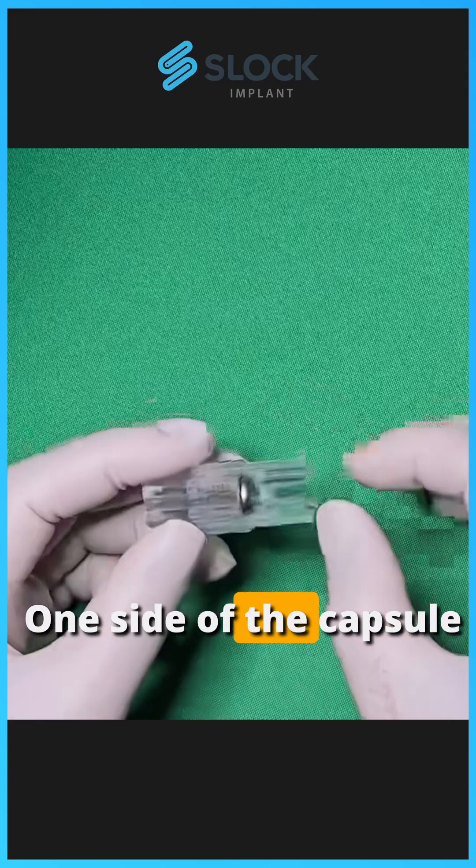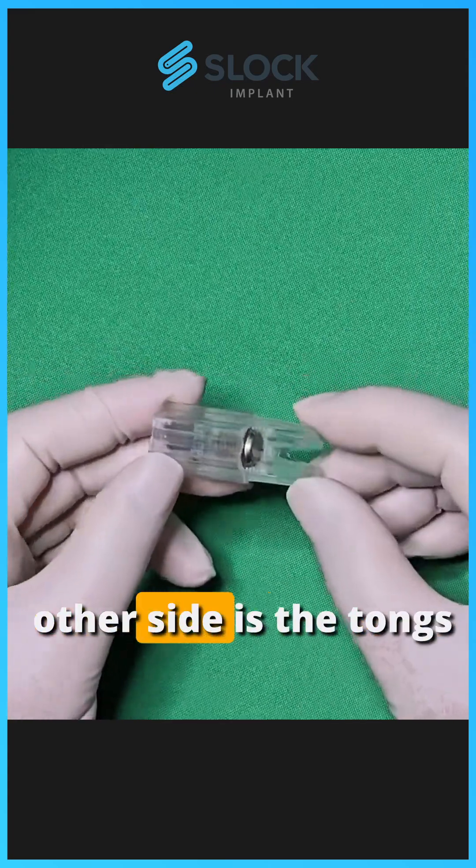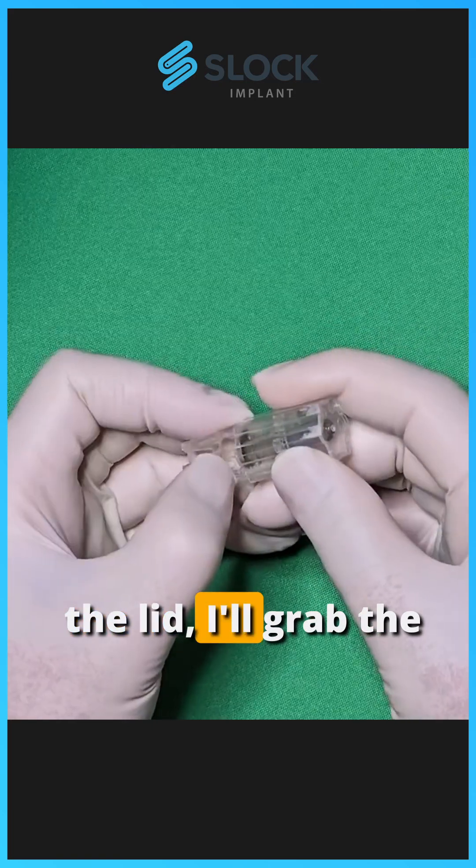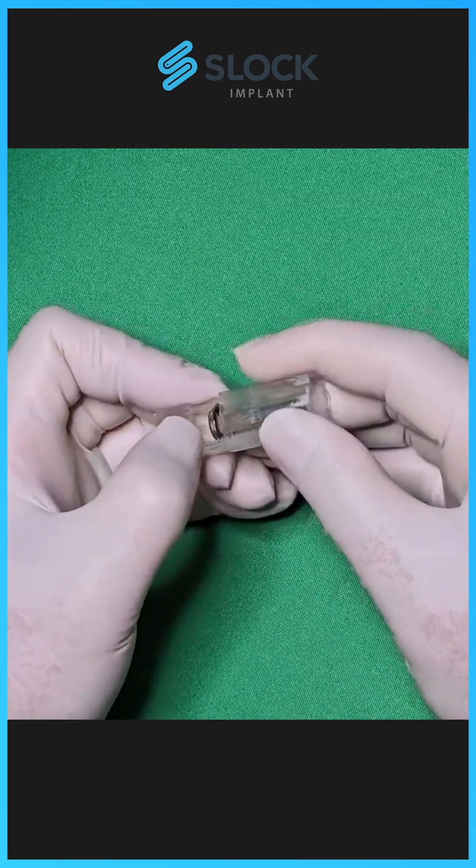I'm going to pick it up. One side of the capsule is the lid, and the other side is the tongs that are holding the fixture contents. So I'm going to remove the lid — I'll grab the lid, slide it up, and it will come off.